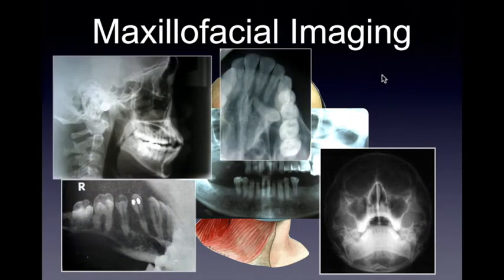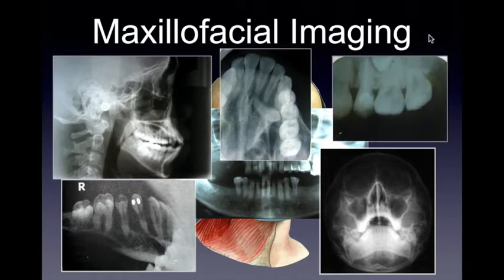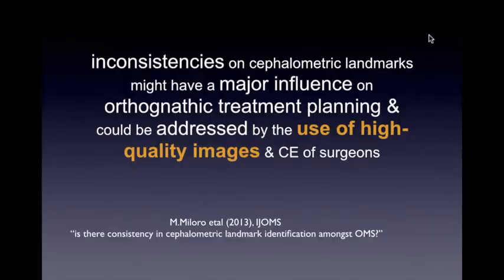These are topographical views for us to identify key structures that may help not just in diagnosis but also be applied in treatment.